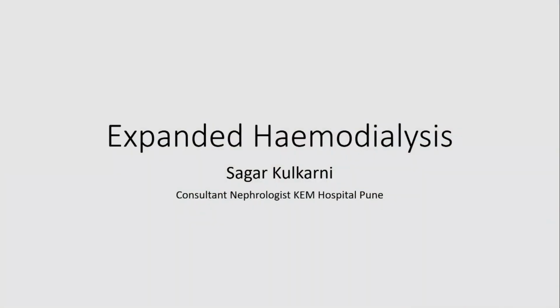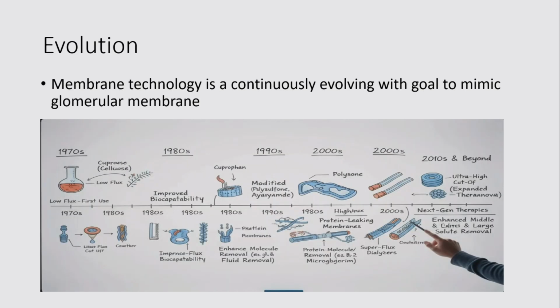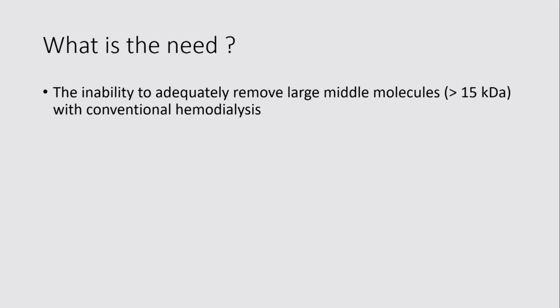Good afternoon, everyone. So I'm going to talk about expanded hemodialysis. It's somewhat newer technologies which are coming up in dialysis. So membrane technology is continuously evolving with the goal to mimic the glomerular membrane. So what is the need for this evolution?